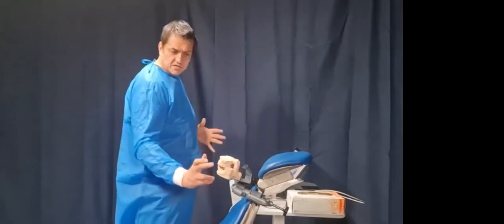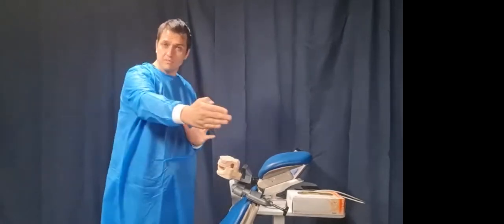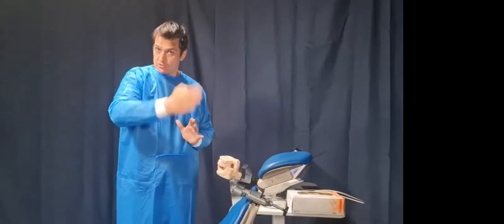So what we want to do is, again, find the most proprioceptive contact points. Start there. Always start there. Then go backwards. Toothbrushing all the way up. Come to the midline. Cross the physical midline of the patient.